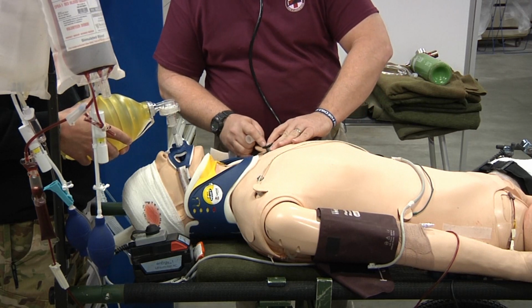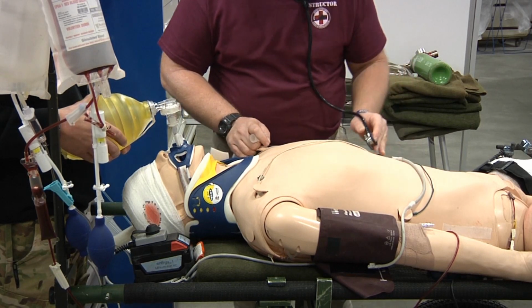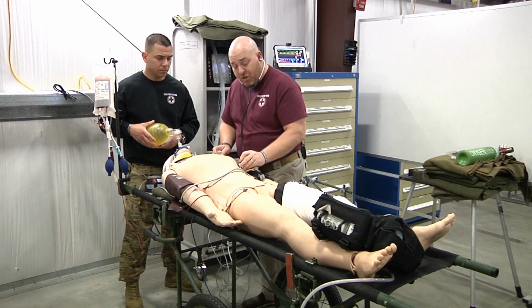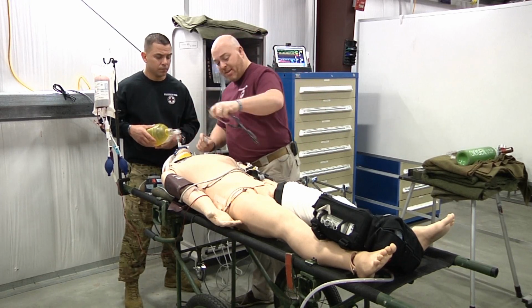I'm going to check apex to apex, base to base, ensuring that I have good breath sounds in 4 quadrants. After that's done, I'm going to lay my stethoscope down.